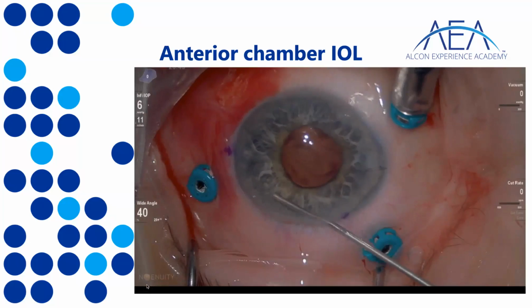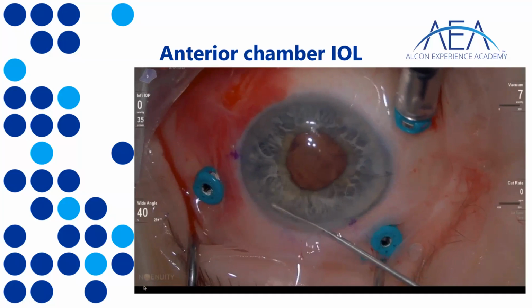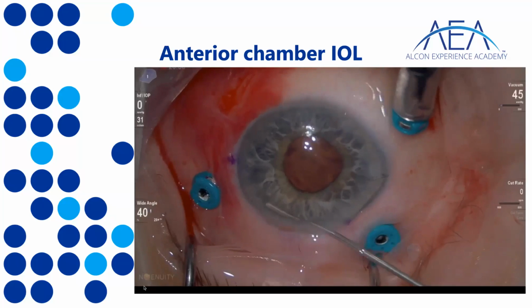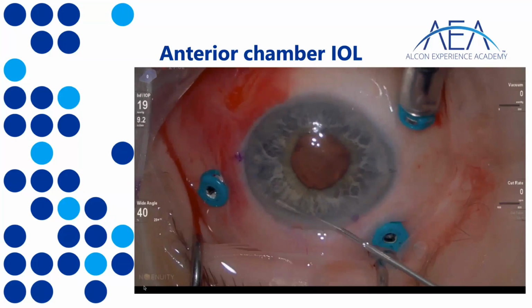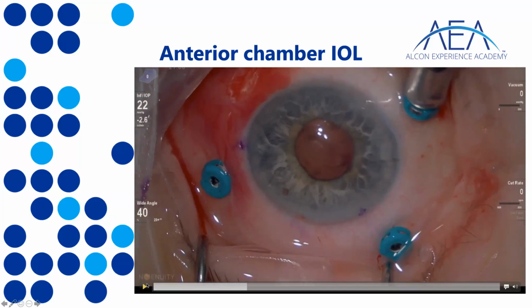The second step is the surgical iridotomy. Surgical iridotomy can be done in very many different ways, with scissors or, in this case, the cutter. In case you use the cutter, I would usually suggest leaving the cut rate very, very low, at about 100 cuts per minute, so as not to create such a large trauma to the iris. Surgical iridotomy is very important to avoid pupil block.